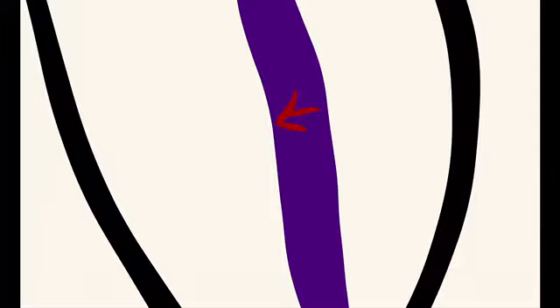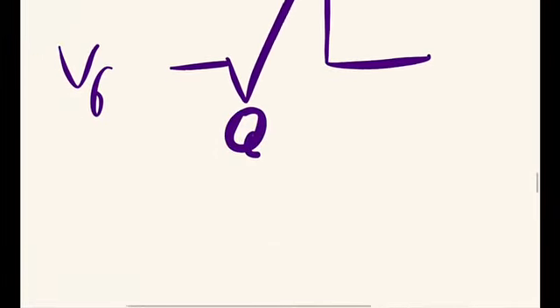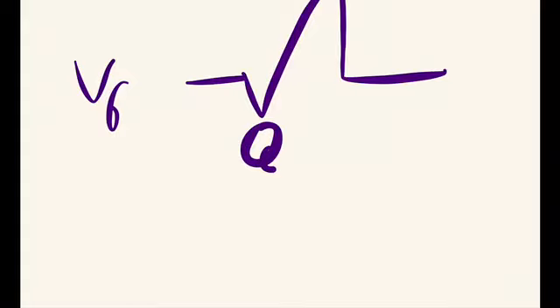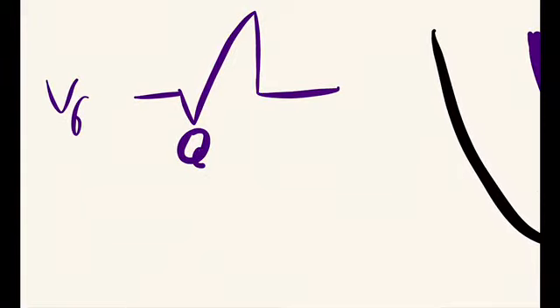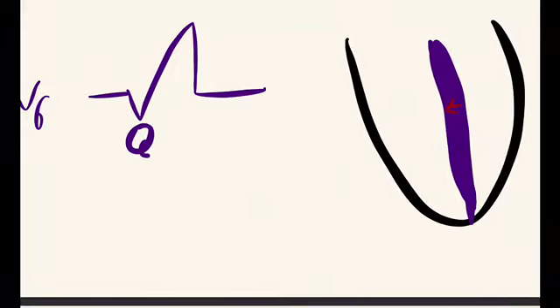And that is giving us a Q wave in lead V6 normally. Okay, but please try to learn this concept, because it is very important. So this was the normal physiology of why we get a Q wave in V6.